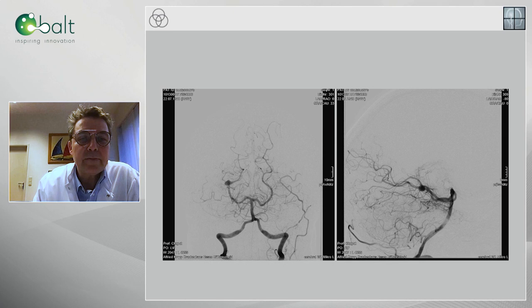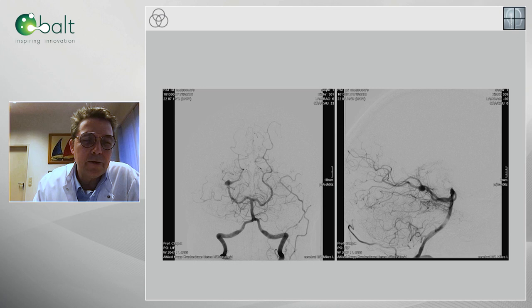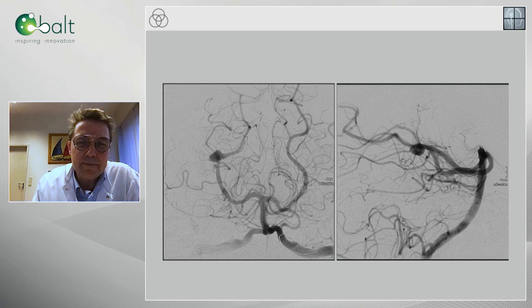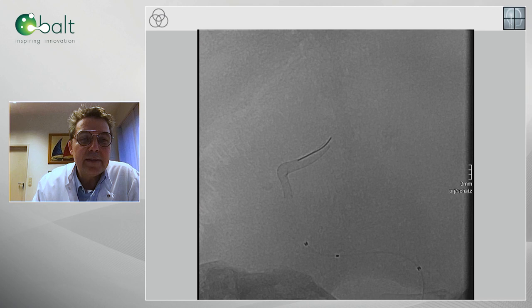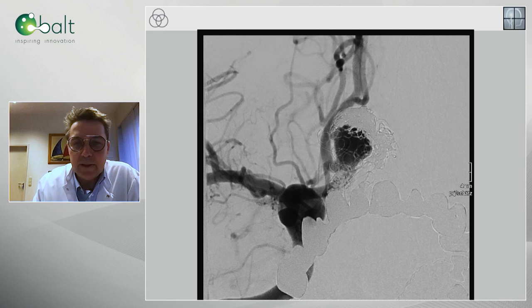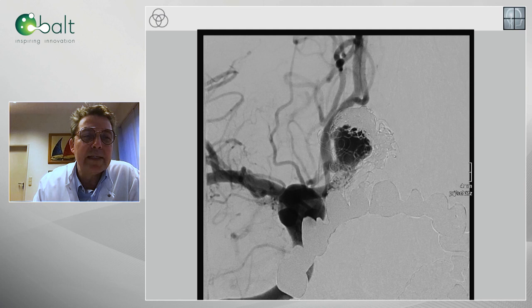Here's a similar situation: dissecting aneurysms in the course of the posterior cerebral artery, where you can go there with most devices. It's not difficult, but definitely if you have to choose between 0.027, 0.021, and 0.017, the 0.017 is going to be the easier one. You see here that the device is about to be placed, allowing very precise positioning because you can replace it as often as you wish.